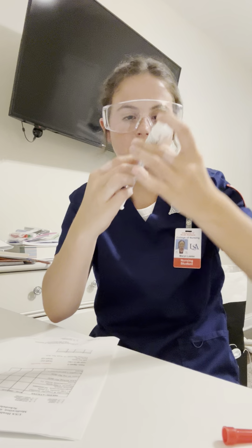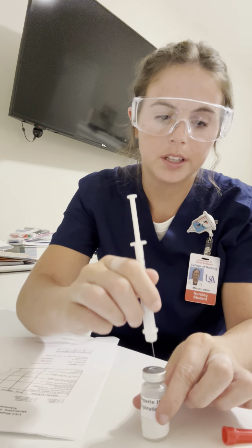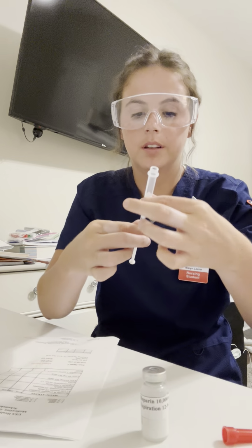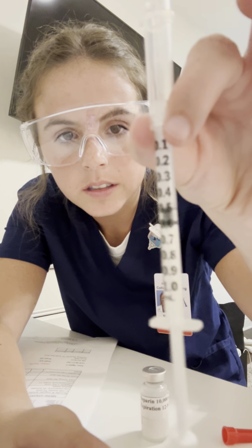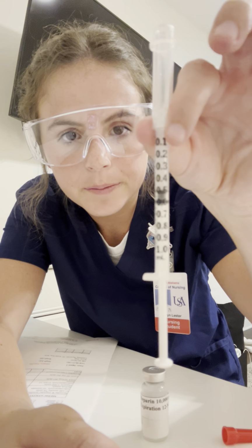Okay. And now I'm going to put the safety lock on it. But we see that we have 0.5 of heparin. There we go.